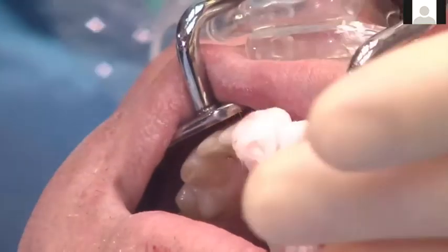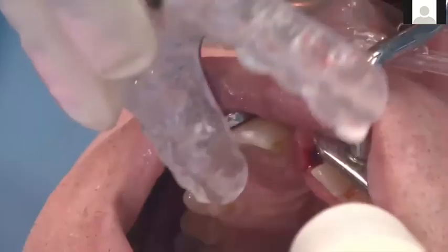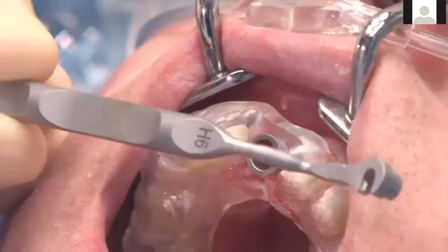Now, some people have also asked me when it's important to do this profiling of the bone. This is before implant placement, so this is bone profiling before the implant placement. I do it on almost every single case.